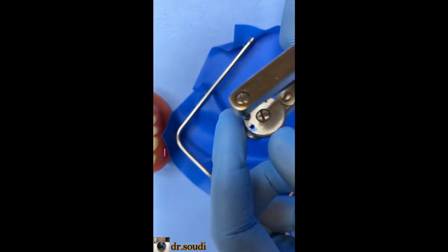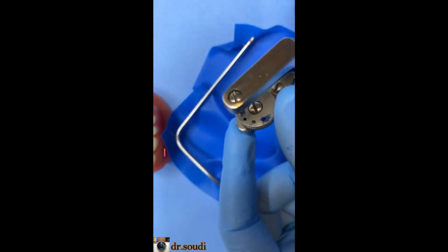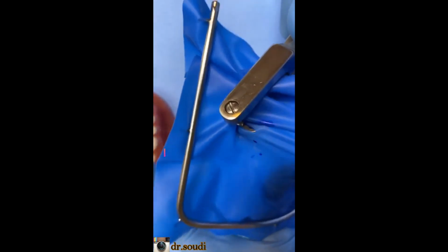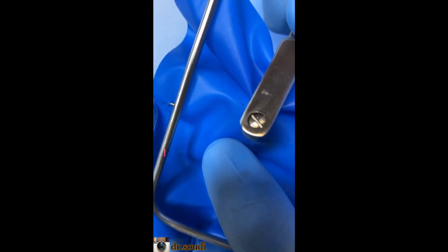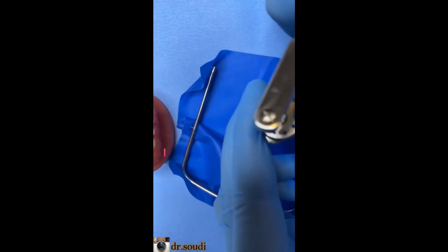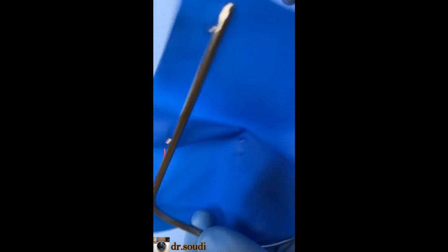Then move your table to get the third one for the premolar like this, and punch, free your hole, punch, free your hole. Now we will have one for the canine like this, the one before the last for the canine.